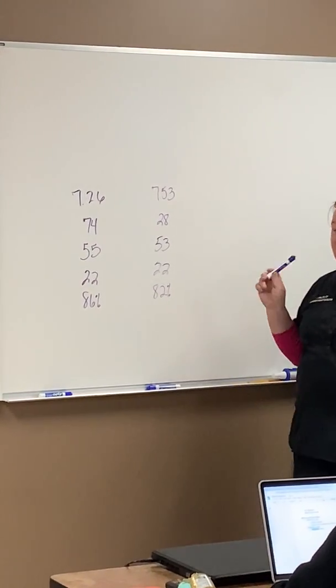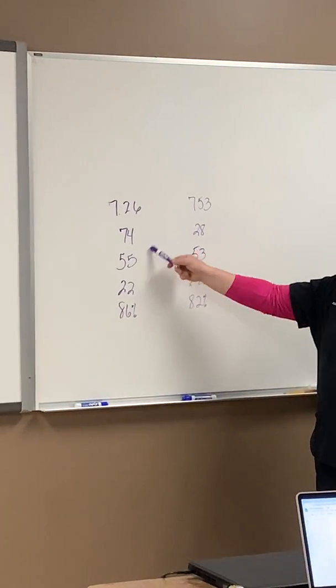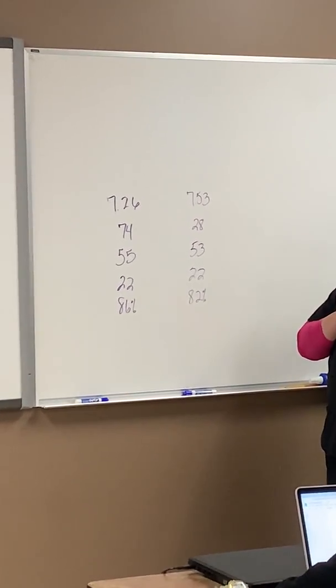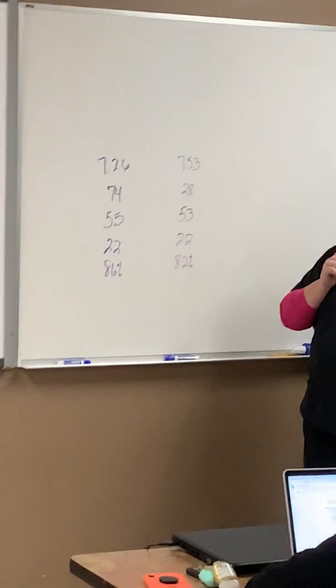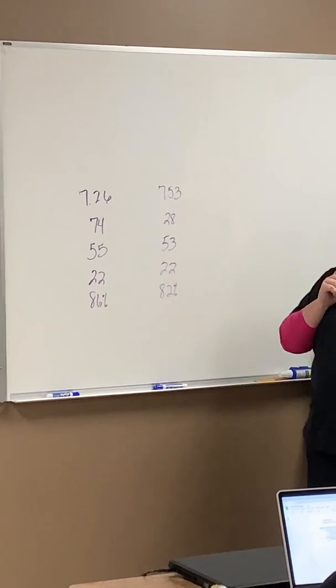When you look at an ABG, what should you decide first? pH. What was the first thing I asked over here? Was it the oxygen levels? Is it a ventilation or an oxygenation problem? That's what you should look at first when you look at your ABGs. So what's the problem here, ventilation or oxygenation? Oxygenation? Okay, that's correct. So how could we fix that?